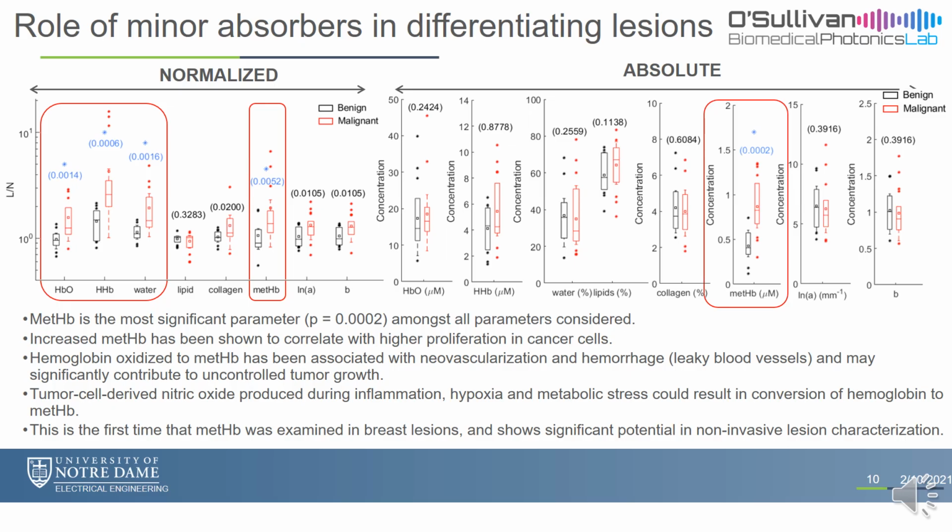I would like to emphasize over here that this is the first time that methemoglobin is being examined in breast lesions, and we have identified that methemoglobin has significant potential in non-invasive lesion characterization.